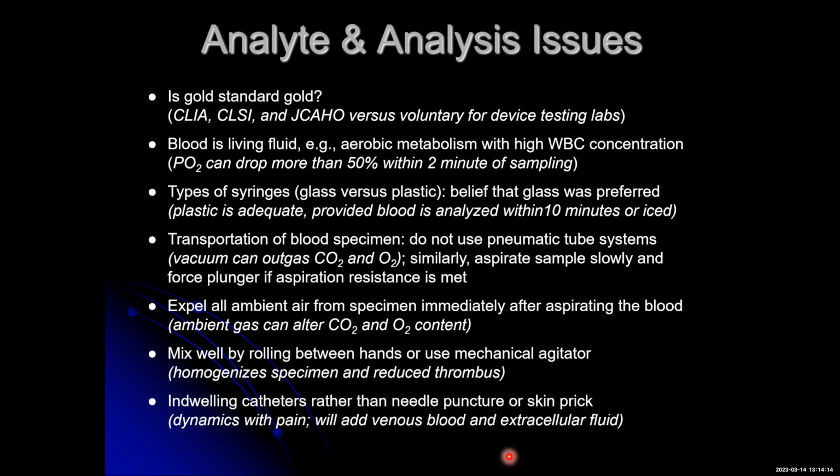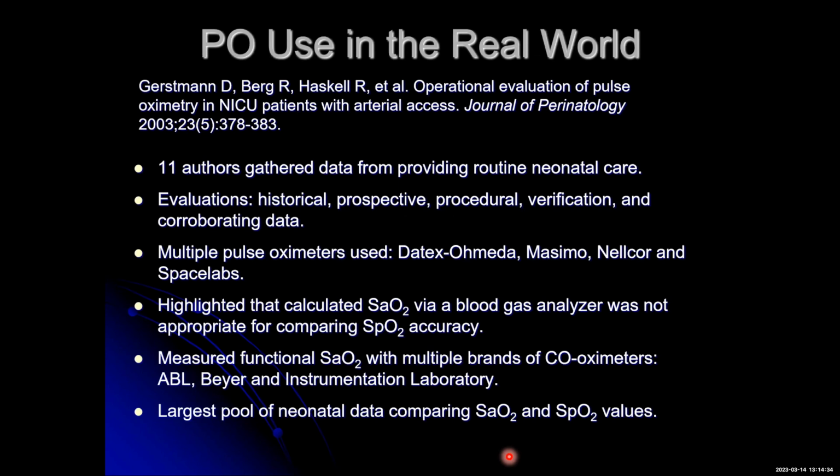This is true especially for neonates or children, where you can't ethically desaturate them. So making certain that you're aware of how to appropriately collect the blood. CLSI has lots of standards on that. So just wanted to make sure that you knew that these extra resources are there.